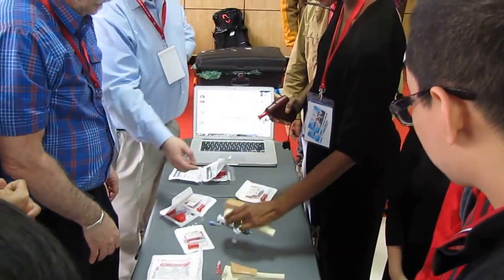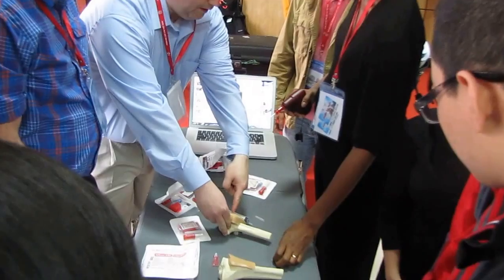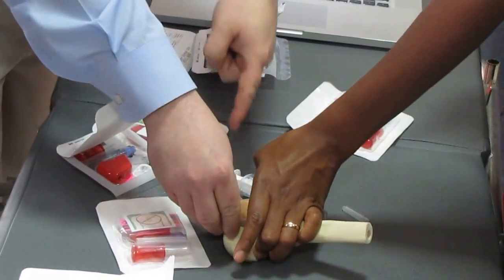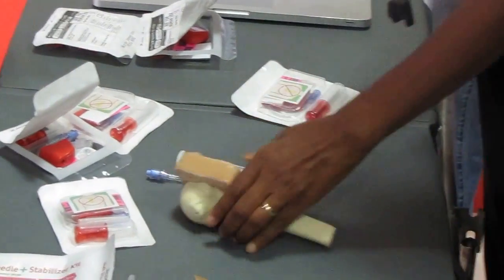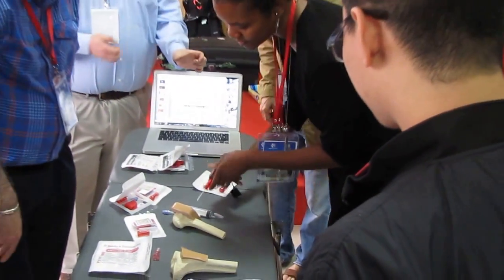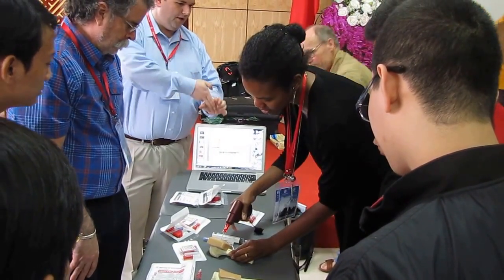The biggest thing, besides that, if you want to take the field — just gonna touch it at the bottom and then start drilling. Don't start drilling two millimeters into the tissue. I find the biggest area I can feel, then go down to the bottom.